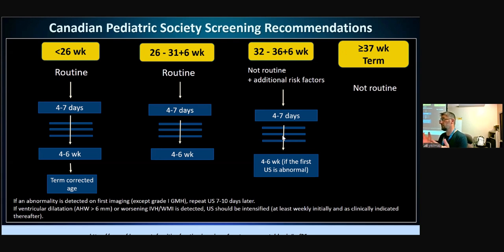But if there is no abnormality, if the first ultrasound is normal or just showing grade 1 germinal matrix hemorrhage, you don't need to do anything else. Just wait for the second ultrasound, which is between 4 to 6 weeks.